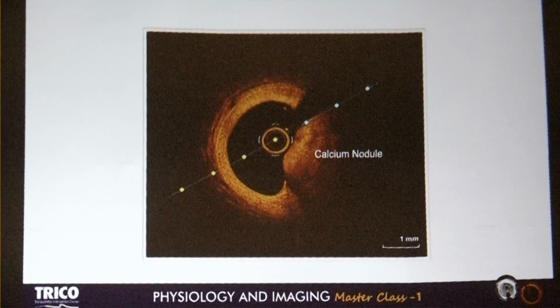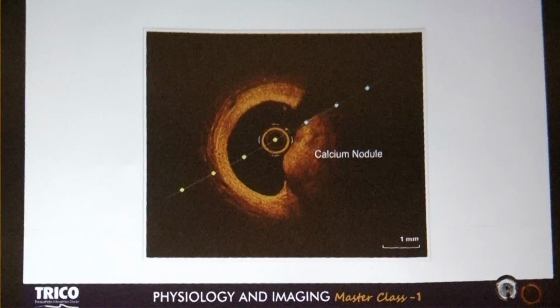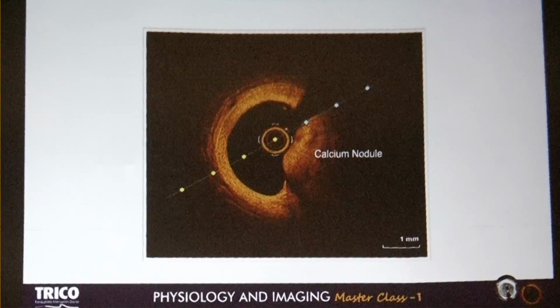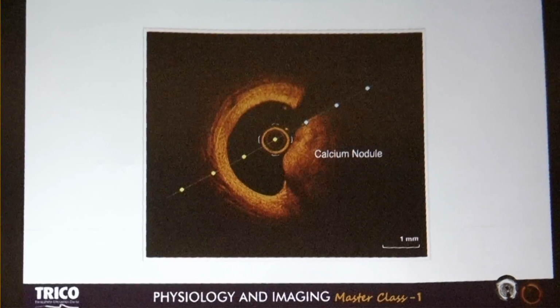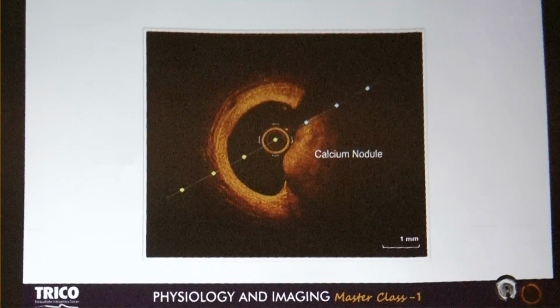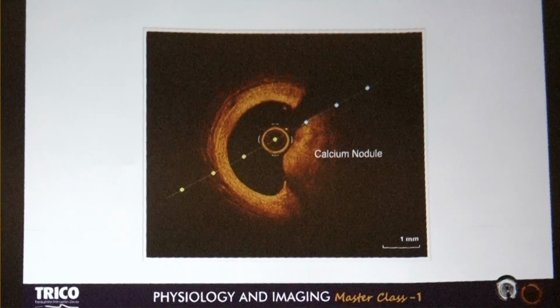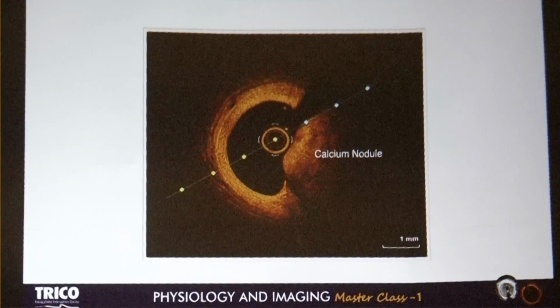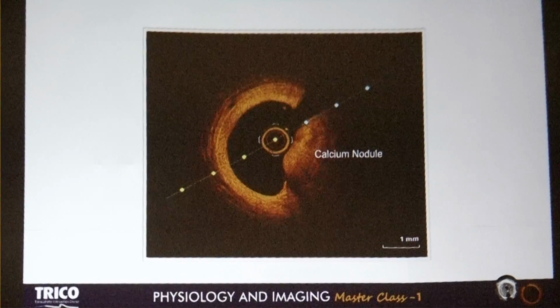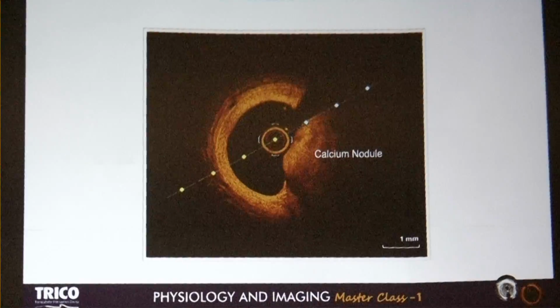Professor Akasaka, what do you think? Yeah, I want to have a longitudinal image, but based on the wire position, we can make an ablation if we want, using orbital atherectomy or something. Yeah, orbital? Yeah, if we succeed to ablate this portion, the result might be much better.